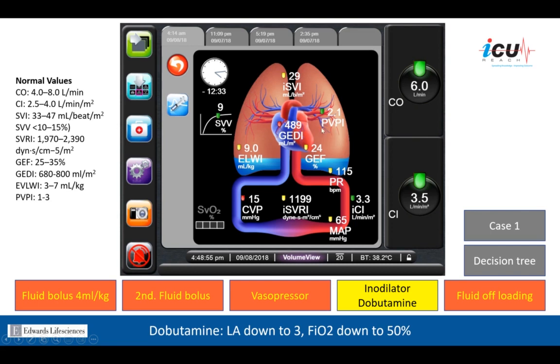However, the increase in the stroke volume for this patient, combined with the increase in the heart rate, increased his cardiac index. Okay. For whatever reason here, the stroke volume variation is improved to 9. But what I would say is probably the best for this patient would have been a fluid bolus to improve his preload and initiating dobutamine to improve the cardiac functions.